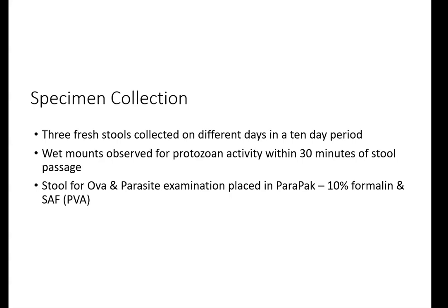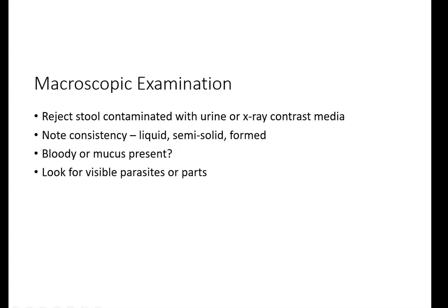So we need three stools collected on different days within 10 days. Okay, three fresh stools within 10 days. The formalin we use more for the wet mounts and looking at them to see what we actually can see there. And if we ever have to do any immunoassay testing to determine if something's present, we would have to use the formalin. You can't use the other fixatives to do that. Okay.